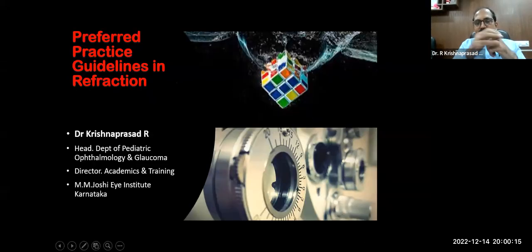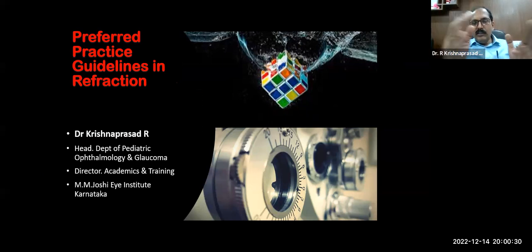So I was just telling that we have finished our objective refraction. So we have come to know what the meridians are and what the neutralization points are. And we have also theoretically found out what the acceptance should be. If the patient is not able to subjectively cooperate, then we have to give the objective refraction only. For children who cannot cooperate, or pre-verbal children, or people who cannot understand, in such patients we actually have to give the objective correction.